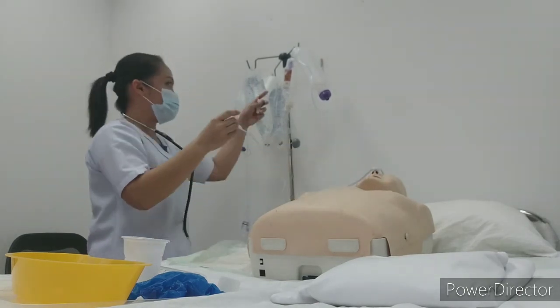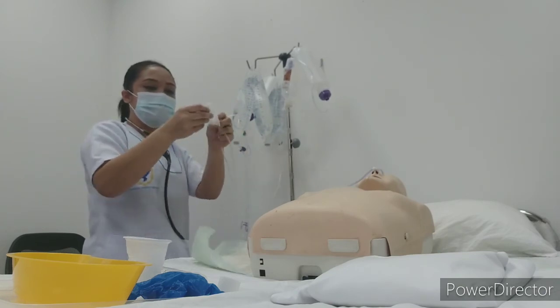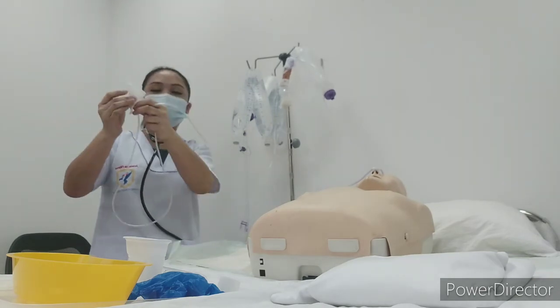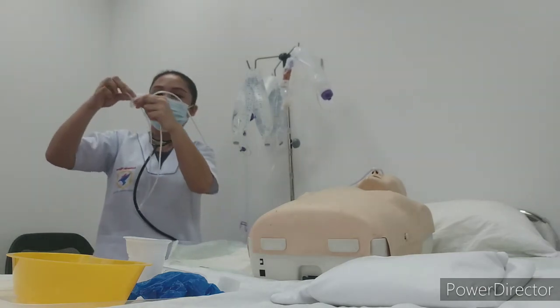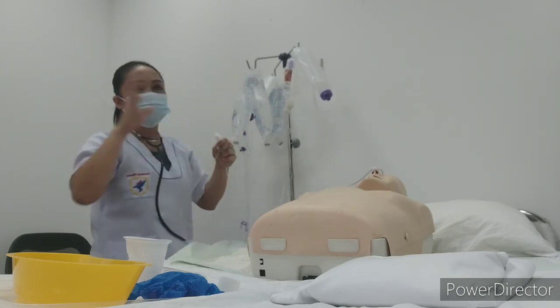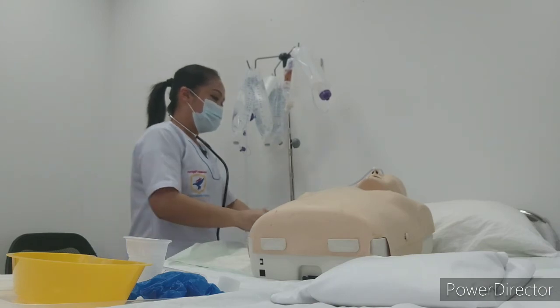So the remaining of this is the 500 ml. We can use it later. So the tip of this, we will close, put the gauze. We will do like this in triangular shape, cover, and then do the plaster. And then remove, put in the fridge, and we can use it later for the next feeding.